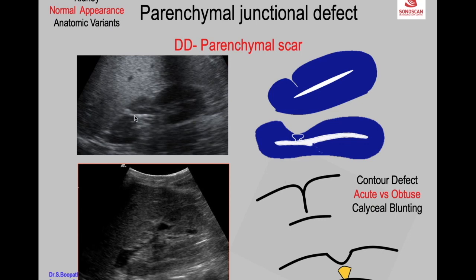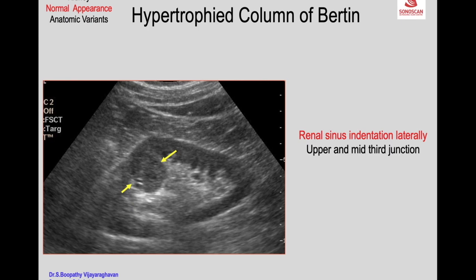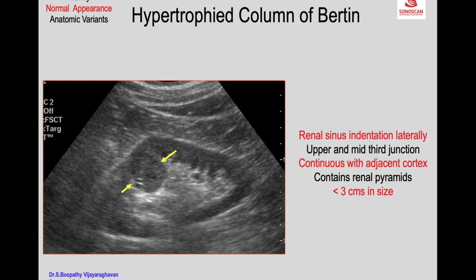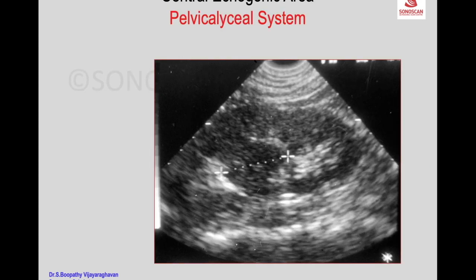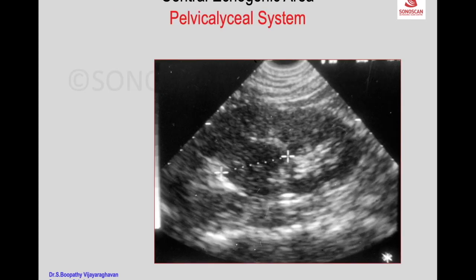The hypertrophic column of Bertin is a normal variation: there is parenchymal indentation on the renal central echogenic area laterally at the upper-mid third junction, continuous with the adjacent cortex, containing normal renal pyramids, less than three centimeters in size, with no contour change. In contrast, a similar appearance with different morphology can represent a TCC, making differentiation sometimes difficult.